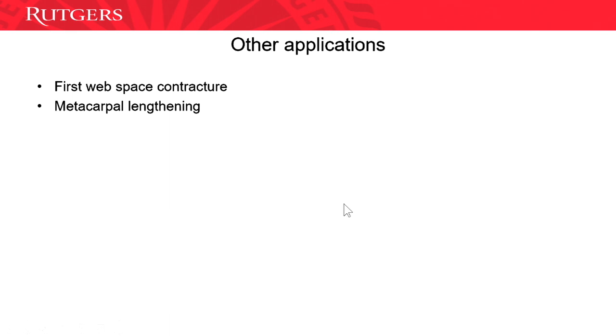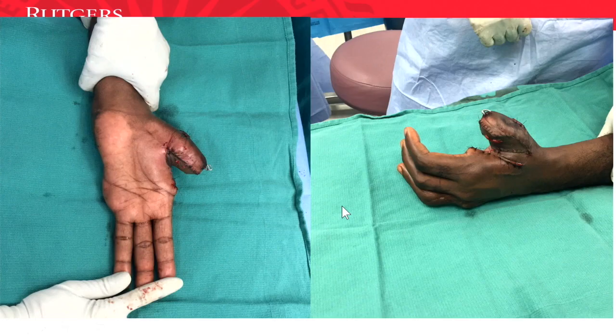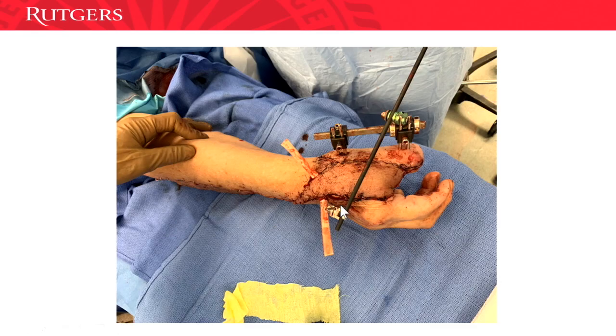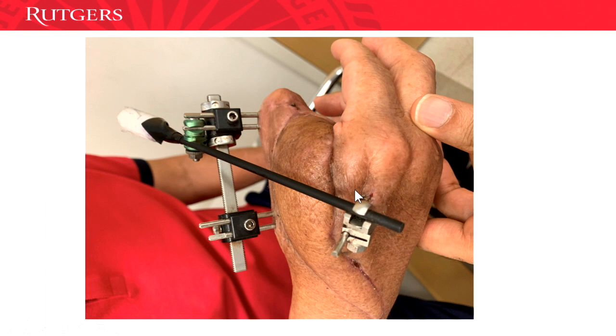And then other applications are you can use them for metacarpal lengthening, which we use in the hand. And if you have a hand compartment syndrome, it helps, because they get a very severe adduction contracture, so you want to put that in to prevent adduction of the first web space.